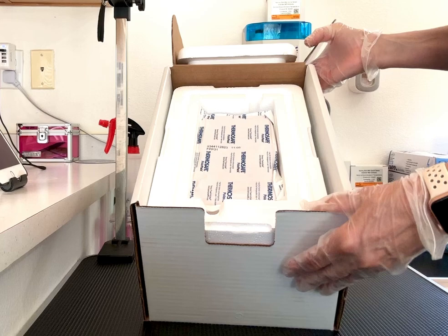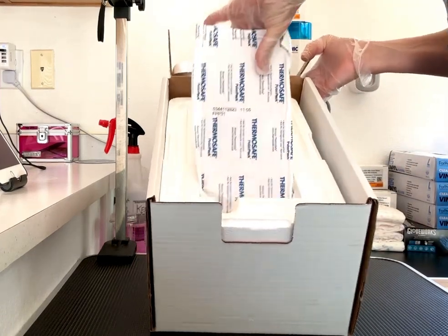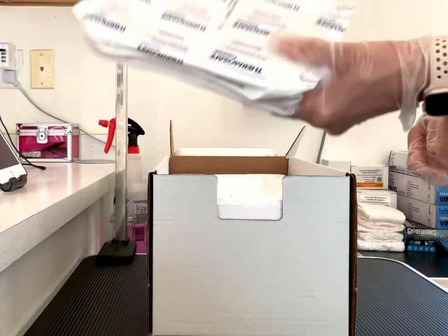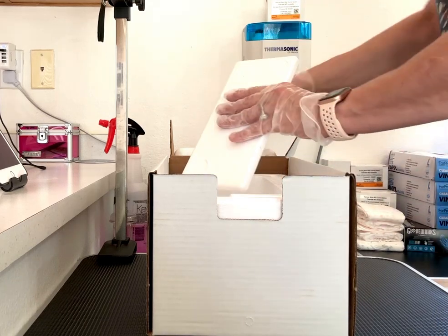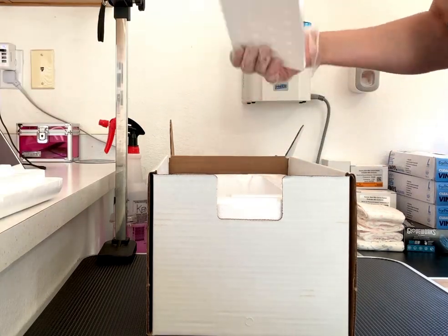I'll give you an example here. There's an ice pack that is keeping the sperm chilled but not frozen. Remember, don't unpack anything until you're ready to inseminate the girl, and this should be done as soon as possible after receiving the shipment.